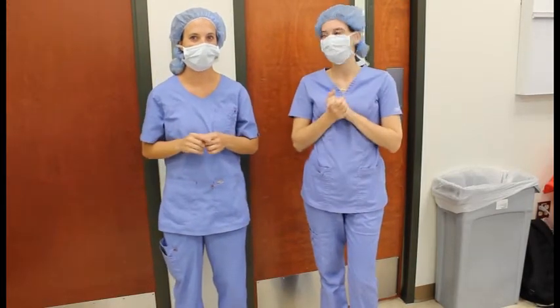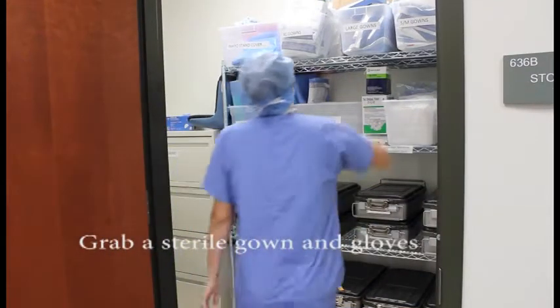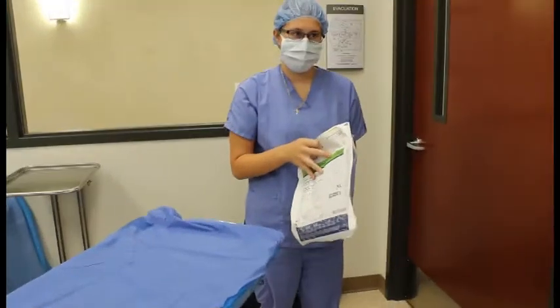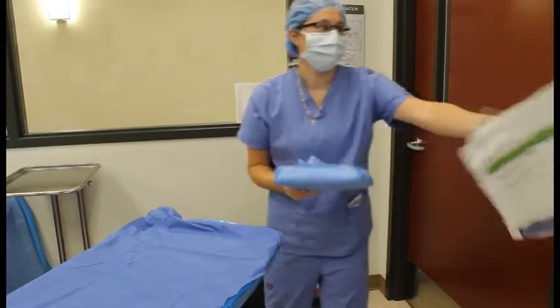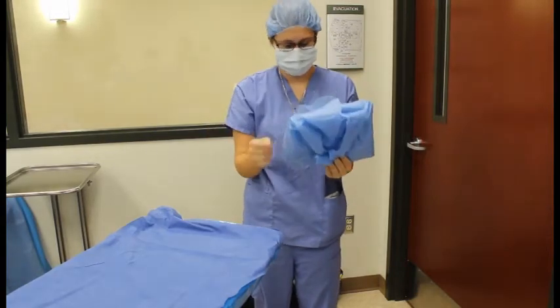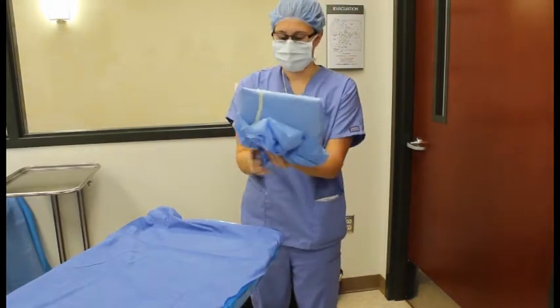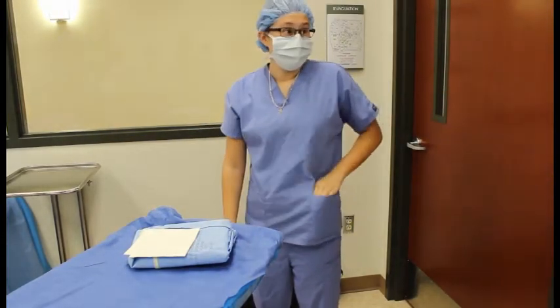And then on to step two: getting your gowning kit. We will now collect our gowns and our gloves. Before we scrub, we're going to put our gown on our sterile mayo stand. One flap at a time, you'll open it, put it in between your fingers like so. And without touching your sterile field, you want to put it on there, along with your gloves.